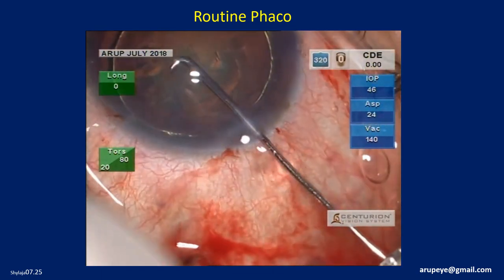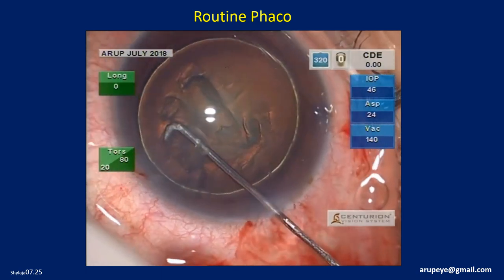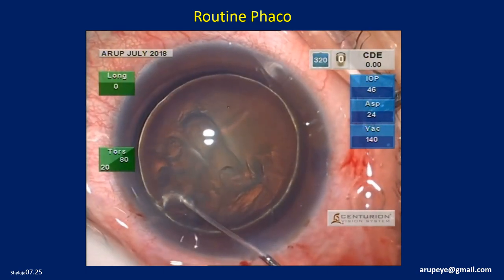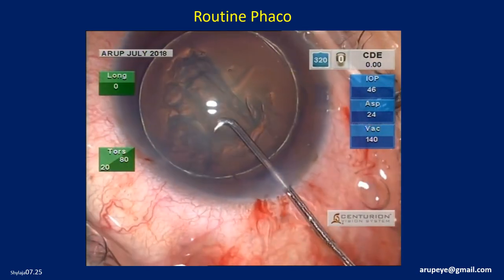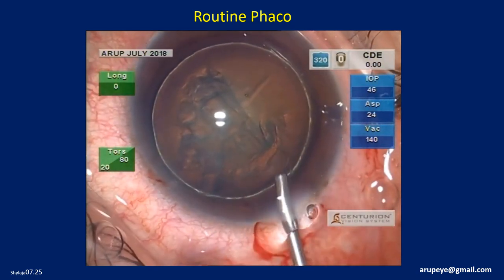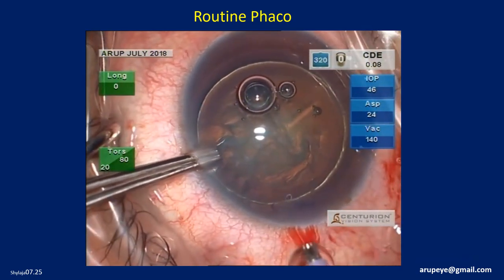A cortical cleaving hydrodissection is performed. There is also an element of unintended hydrodelineation, resulting in the golden ring sign which is clearly visible here. The nucleus is balloted posteriorly to let out the fluid accumulated behind the nucleus.